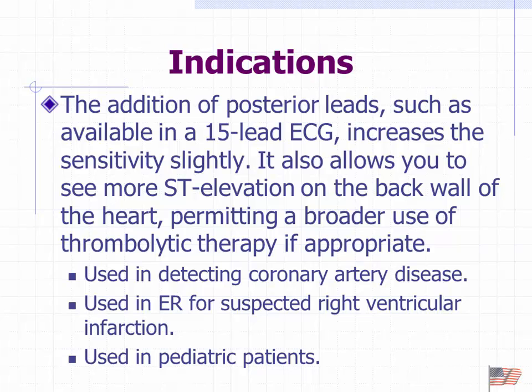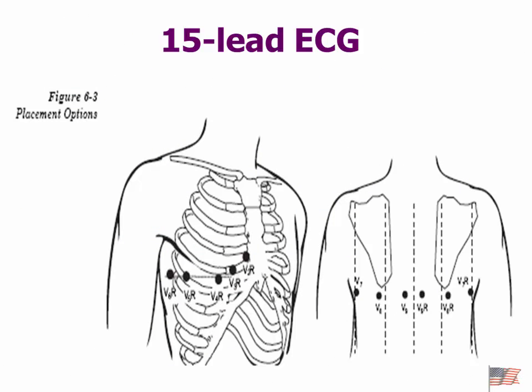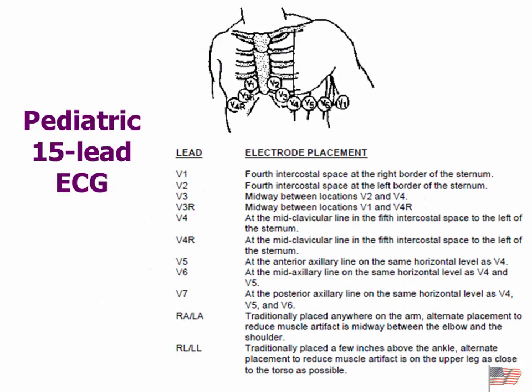The posterior, we can actually have a 15-lead EKG, which is more sensitive. Every time you add another view, you get some more information. And we do this a little bit with pediatric patients also. So we're doing all these additional leads that are placed onto the patient. And kind of give an idea, though. Don't expect you to memorize these, please. Let's just stick with the standard 12. I'm just bringing it out that this could be something that would be requested of you.